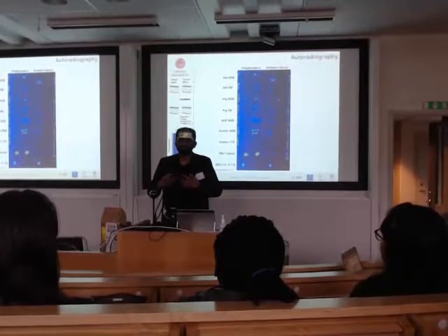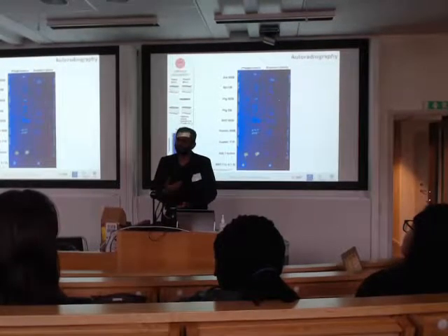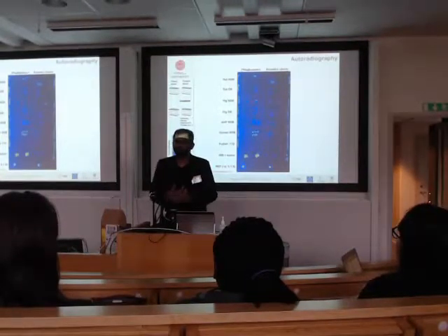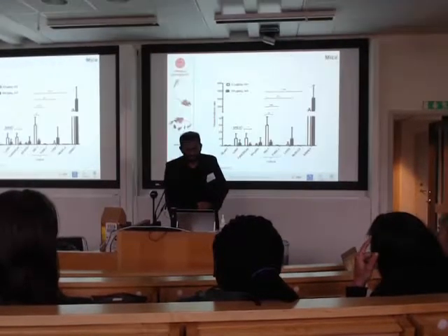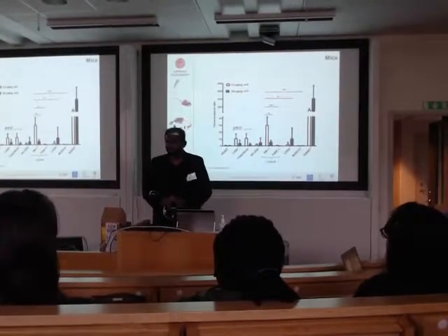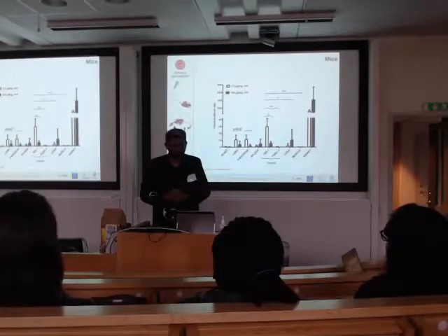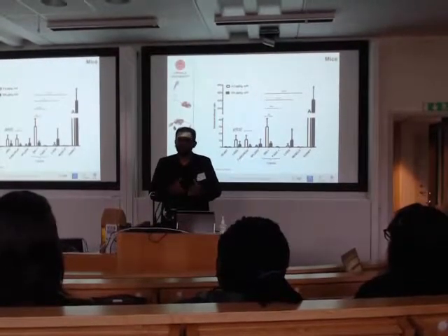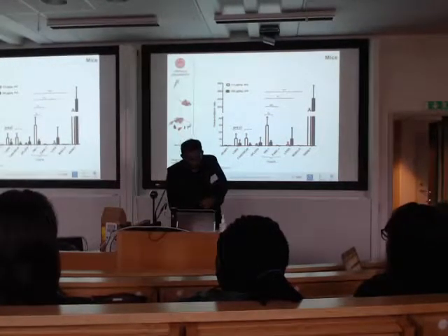But what you want to do is to take it to the clinic. When you subject this tracer to your bloodstream, there are tons of enzymes that can cleave your proteins and other things. So the next step, if this is convincing, is to take it to animals. We start with small mice scans, nude mice scans. Even to start with, we check the in vivo stability in normal mice, to see if it's good enough and if it binds specifically to the organs you're looking for. If that's convincing, sometimes we take tumor models as well.